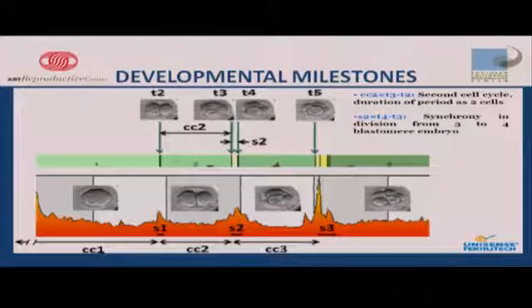So we also use time points in development. In the oxygen discussion, previous group, and in this group, you actually find that there are time points of when embryos need to sit and rest, when they need to replicate, if they take too long or too short a period of time, and watching for those bad signs that I just showed you. So we can use those time points: time to get to 2 cells, to 3 cells, time it rests between 3 and 4 or does not rest between 3 and 4. Does it go too quickly between things? We use all of these things and start to rank which ones are the most important when we get past eliminating the abnormal divisions. So that's what we start to do.